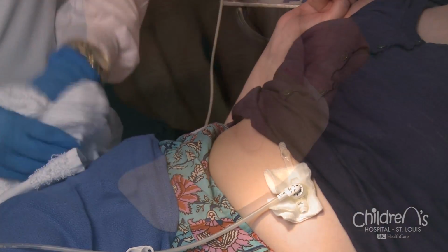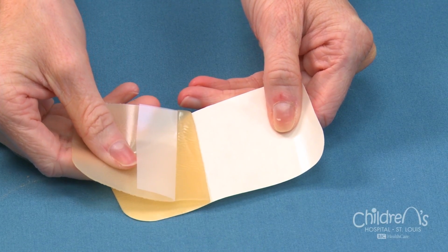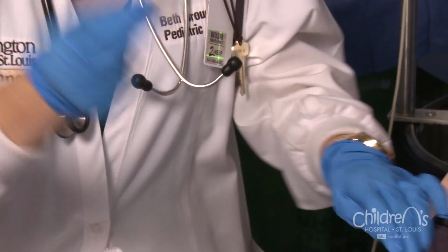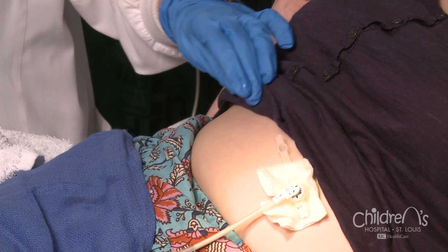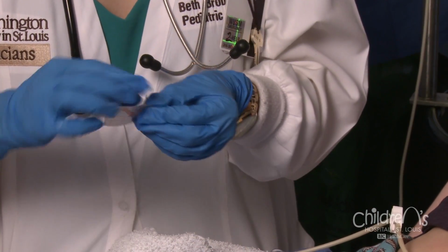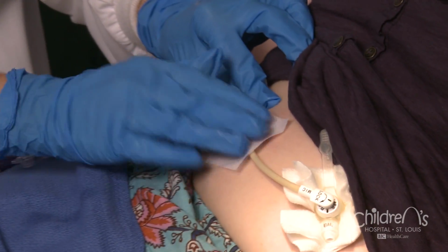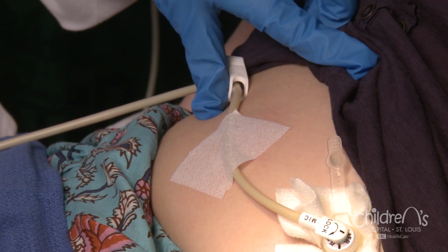If your child's skin is irritated, your surgery team may order a special dressing, known as Duoderm. Wipe a skin prep pad on skin where the tape will go and, if needed, where the Duoderm will go. After the skin prep gets sticky, lay the extension set on the skin prep and cover it with tape. Remember to move to different spots to help prevent skin breakdown.